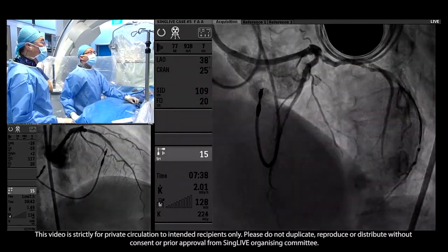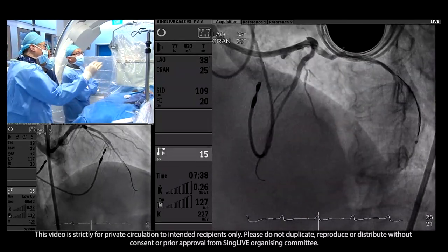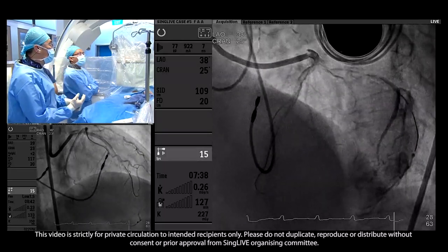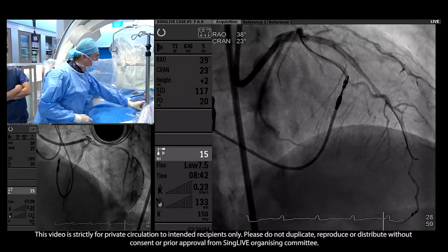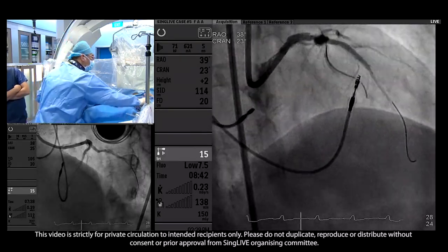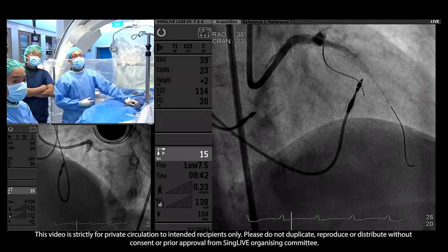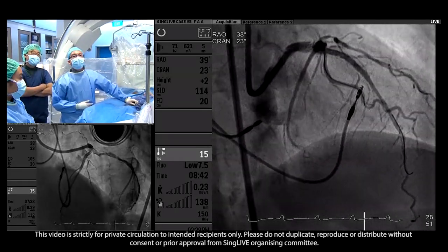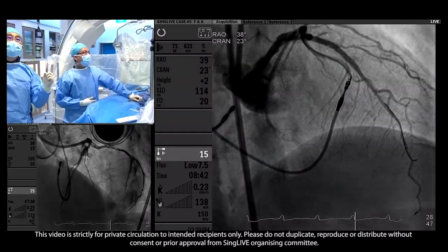So, Jonathan, with the IVUS finding, would you still persist with this DEB approach, or do you think otherwise? I think I'd want some more modification. More modification, okay, with whatever tools are available. The dissection hematoma is on the LAD side, not the circumflex side. So 3.5 is out of it. Yeah, 3.5 LAD to left main stent.